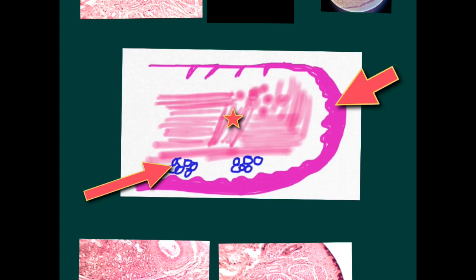The first slide in this group is the lip, which is covered from both surfaces by stratified squamous epithelium. One surface is the skin and the other is a mucous membrane. How to know the slide of the lip? It is U-shaped, and it is formed of a bulk of muscle at different directions.